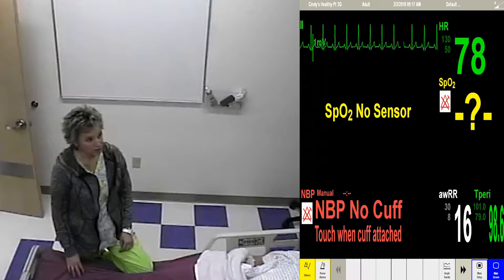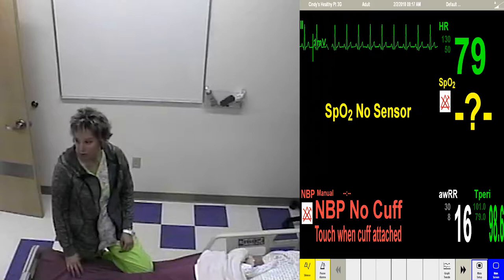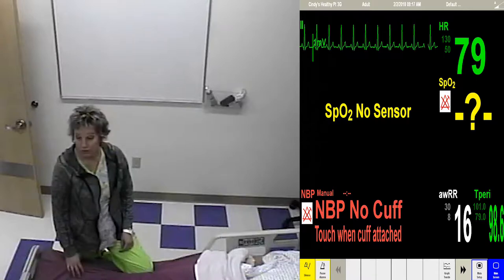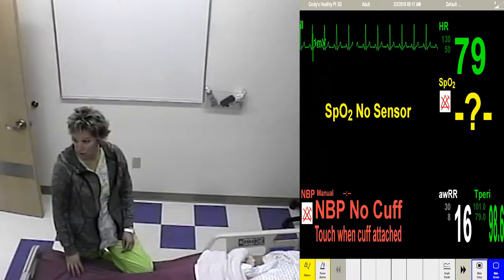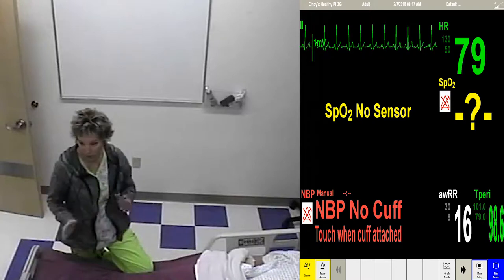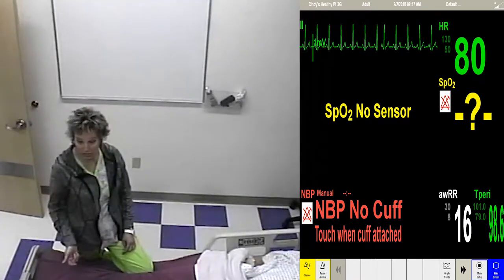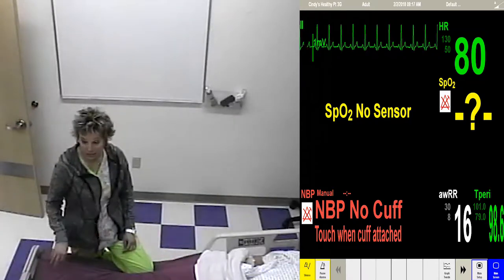Okay, do you hear the beep? That's each heartbeat. Bob your head in rhythm of the beat. Is it regular? Yes. If you answer yes to all of those questions, then this rhythm is sinus. Now don't say sinus tach, sinus brady, any of that yet. Just say sinus, okay? So did you answer yes to all of those questions? Yes. So this rhythm is sinus.